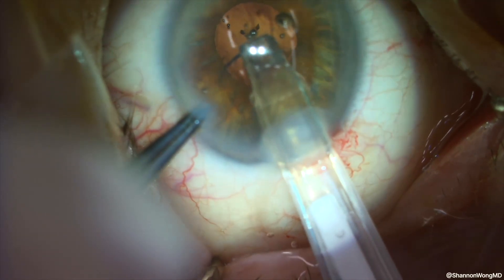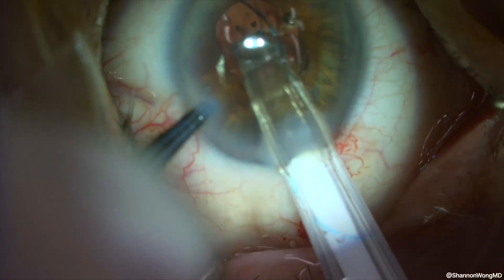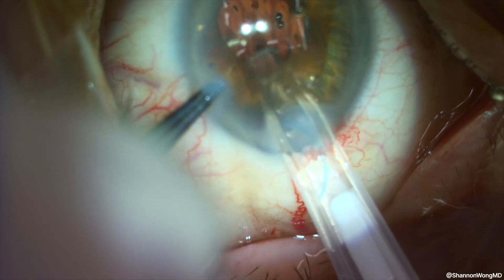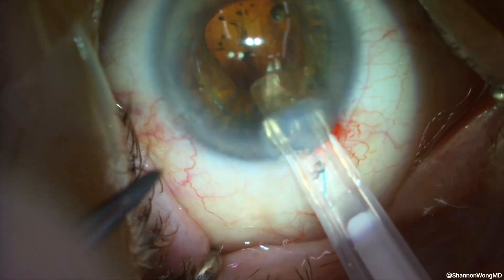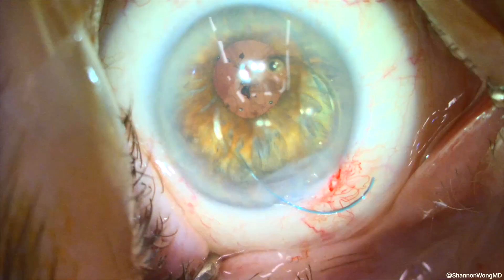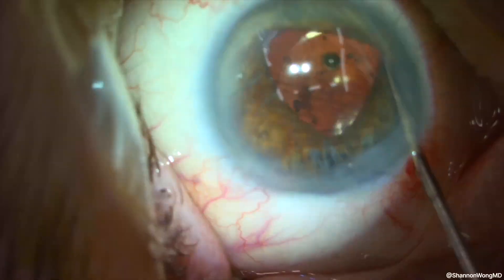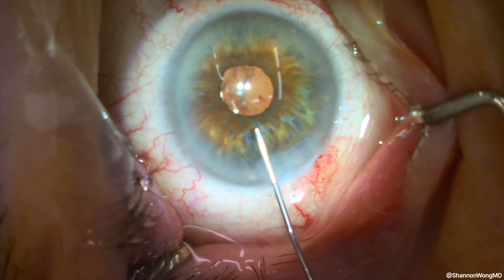This eye has already undergone pars plana vitrectomy. We insert our Bausch + Lomb LI-61AO lens into the anterior chamber, which has been filled with viscoelastic. Our plan is to dial the haptics behind the iris and into the ciliary sulcus, then place the optic posterior to the anterior capsule. Because the pupil is miotic, it's a bit challenging to move the haptics into position, but we eventually prevail. Additional viscoelastic is placed into the anterior chamber to viscodilate the pupil.